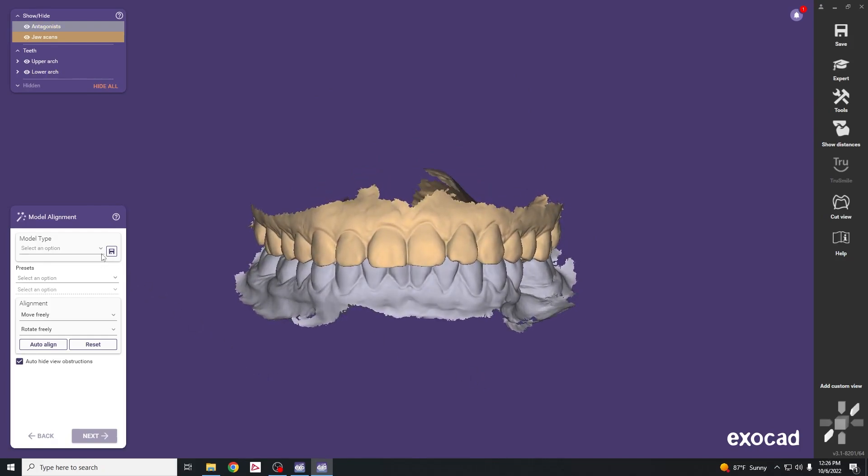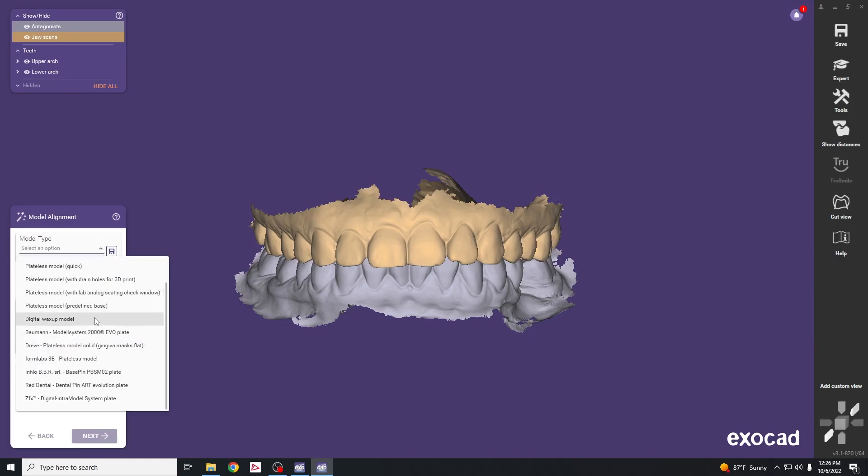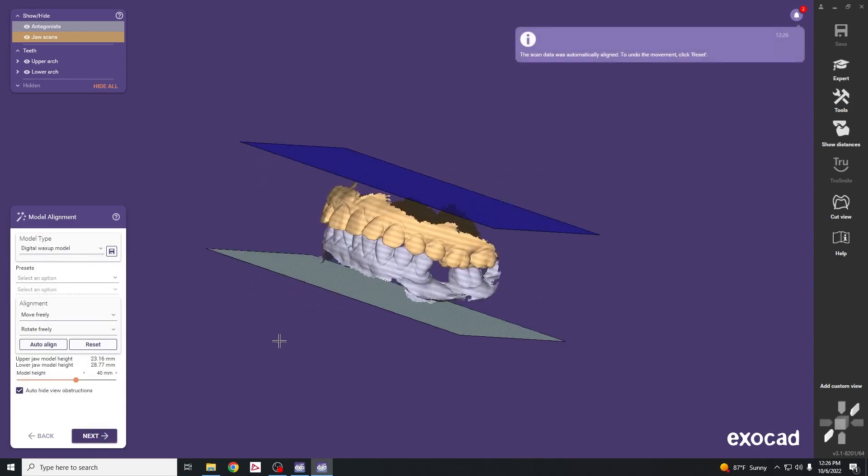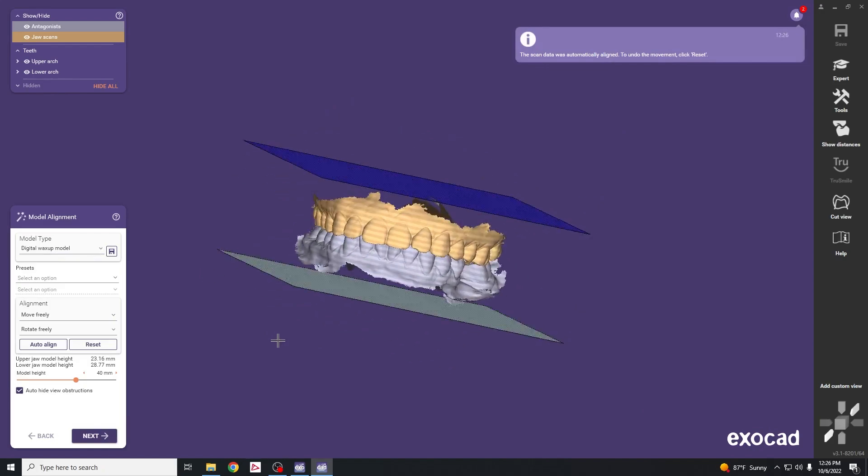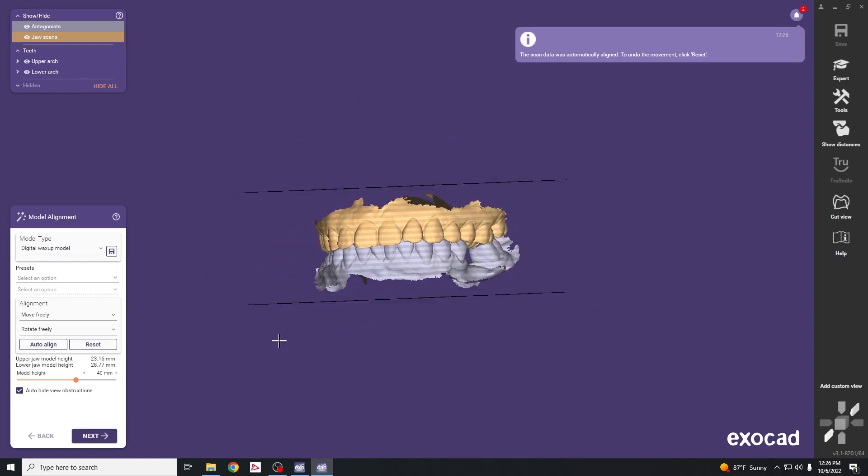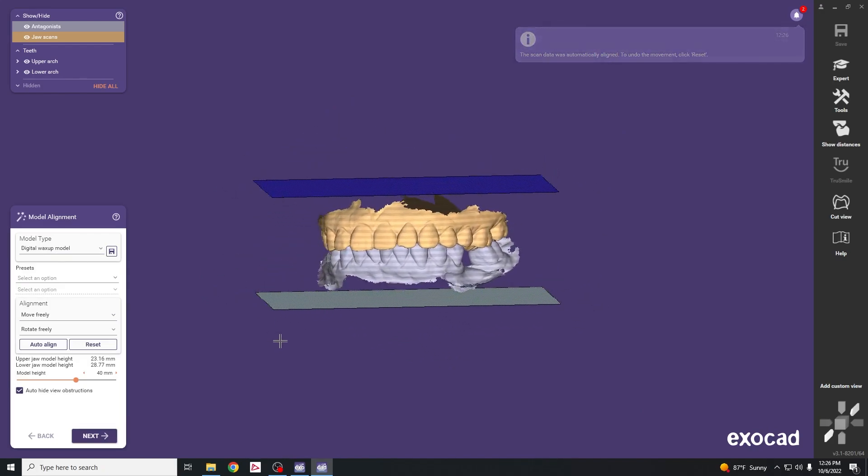The next step is to select model type and we're going to select digital wax up model.